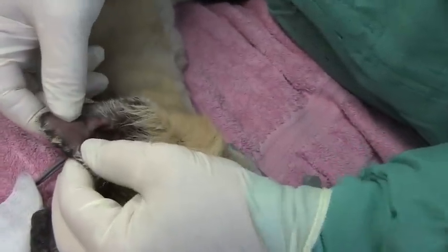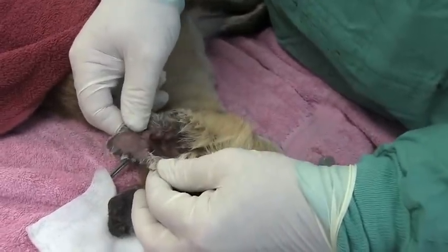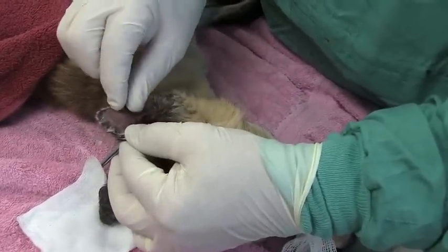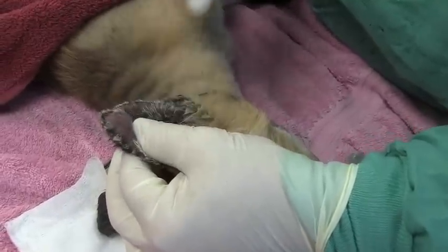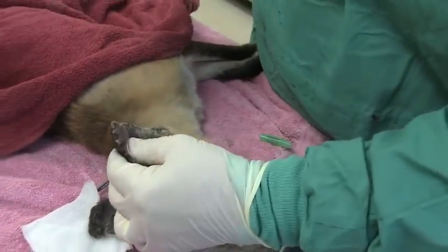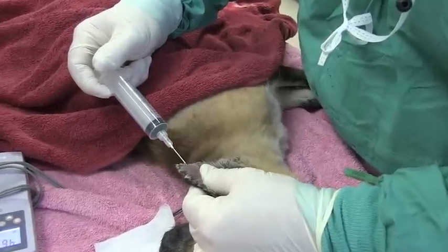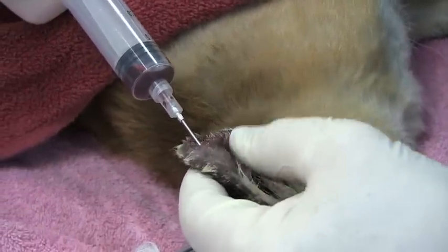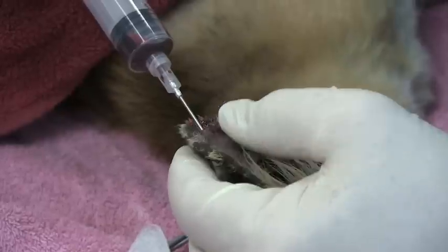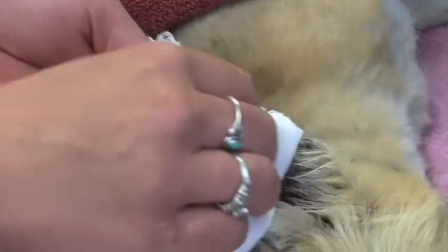This hematoma is relatively small, so it has just started. Sometimes they involve the entire ear, and in that case we would poke fairly large holes in this side so that the serum and blood could drain out. In this case, since it's fairly small, right around this area here, I'm going to place a sterile needle into the ear. We're just going to ease it in here and try to deflate this ear, take the serum out of there and any clots that we can suck out. Just like that.